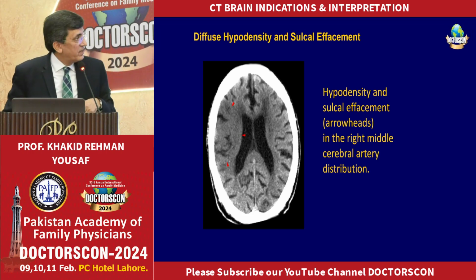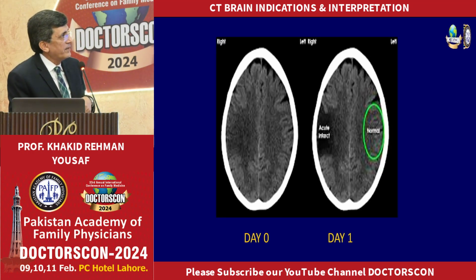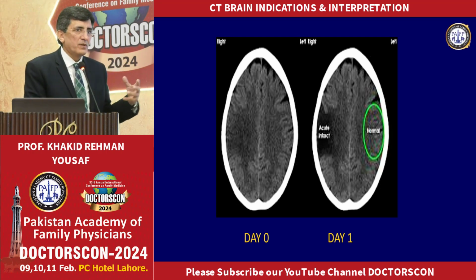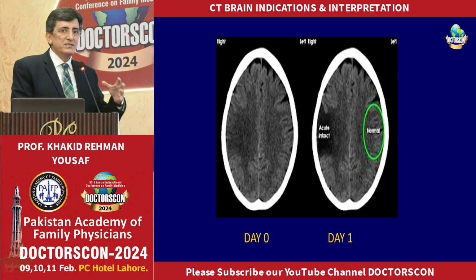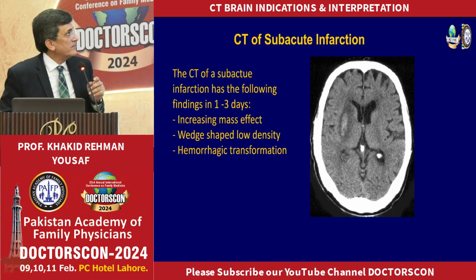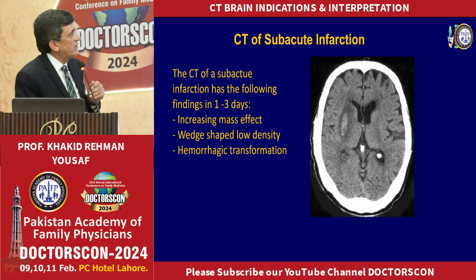Is evaluated. There would be evolution of this in further hours. By the end of one day, it's very clear. This is day 0, and up here, this is the normal side. You see normal sulci and gyri pattern, and this is hypodensity due to cytotoxic edema. The stroke has evolved. So confirming that it's not a bleed, it's an ischemic stroke. This is not a hemorrhagic stroke. Subacute, again, within 1 to 3 days, the patient may bleed in the ischemic stroke.